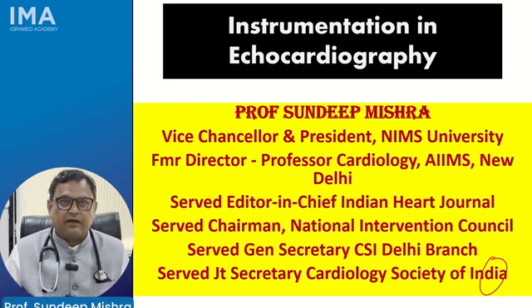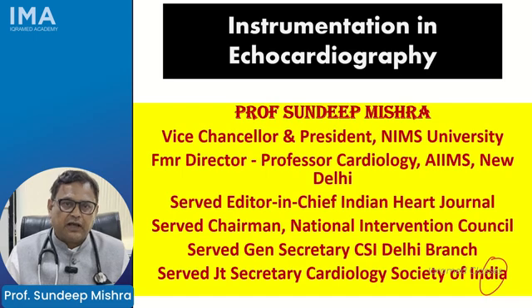Hello friends, welcome to module 3. Today we will talk about instrumentation in echocardiography.